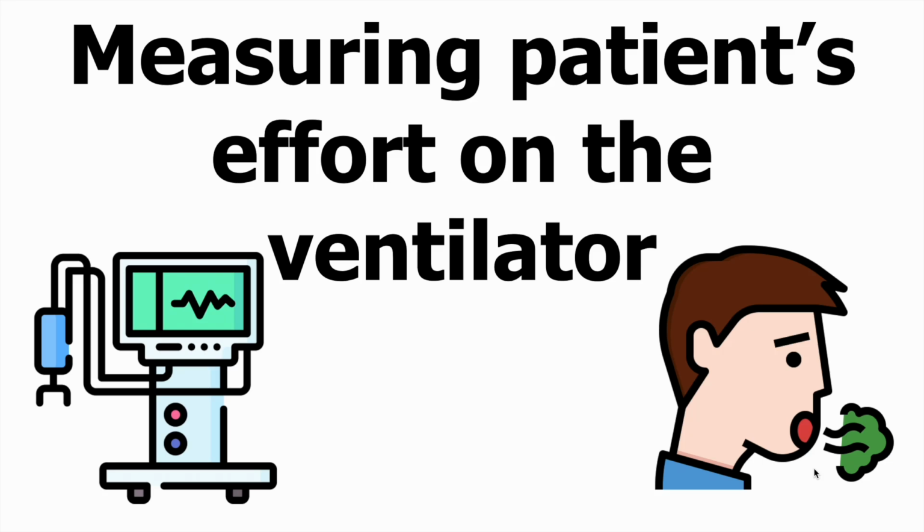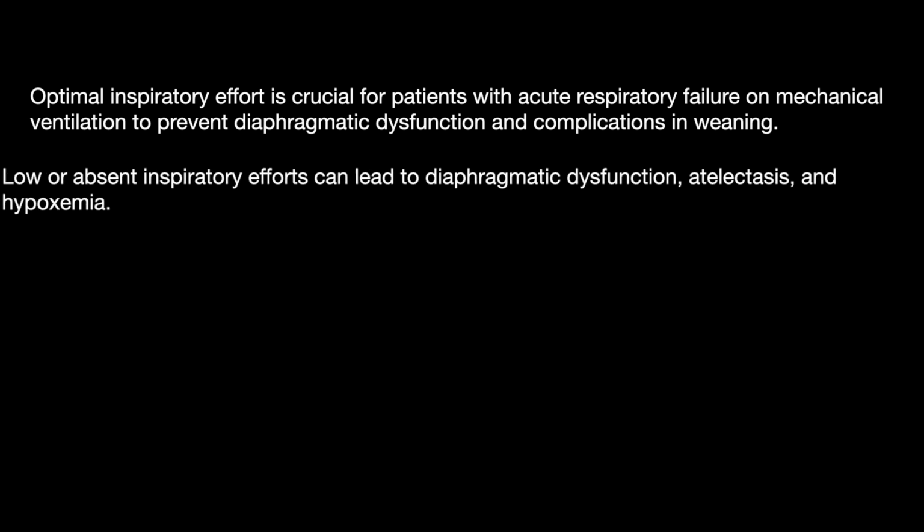Hello and welcome everyone. Today we will be discussing an important topic, that is measuring patient's effort on ventilator. Optimal inspiratory effort is crucial for patients with acute respiratory failure on mechanical ventilation to prevent diaphragmatic dysfunction and complications during the weaning period.